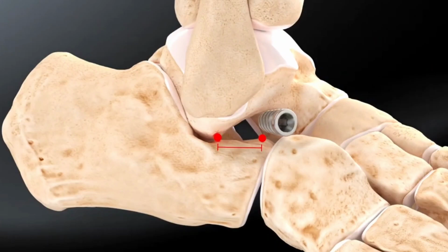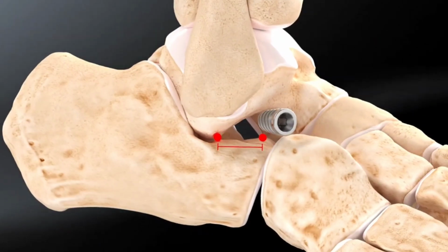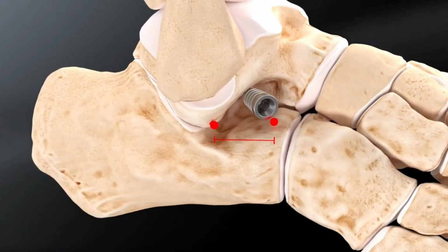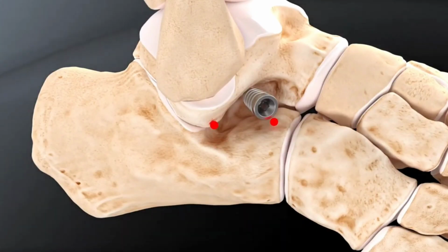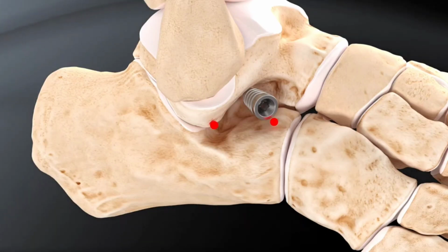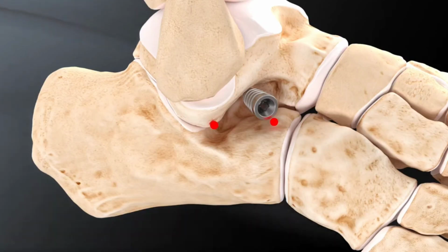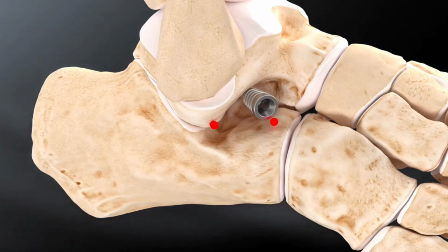The ProStop subtalar arthroereisis implant functions as a free-floating splint in the sinus tarsi. It prevents the approximation of the two processes of the talus and calcaneus, correcting the anterior translation of the talus over the calcaneus. Simultaneously, it forces the calcaneus out of hypereversion, positioning it back in its physiological position under the talus. As a result, it also facilitates the relocation of the talus in its physiological position above the calcaneus.